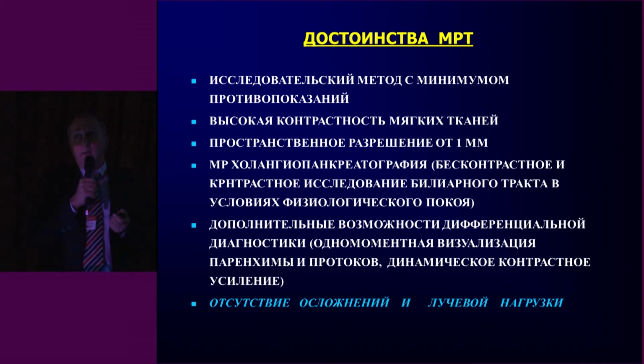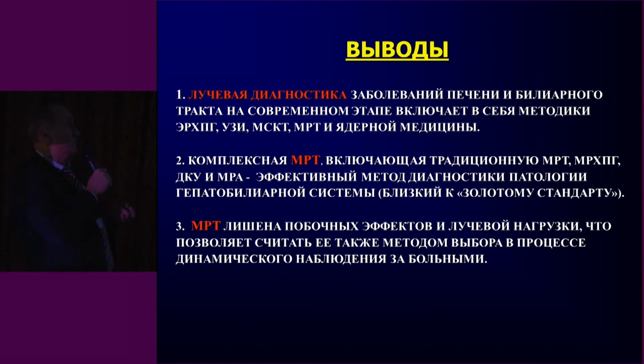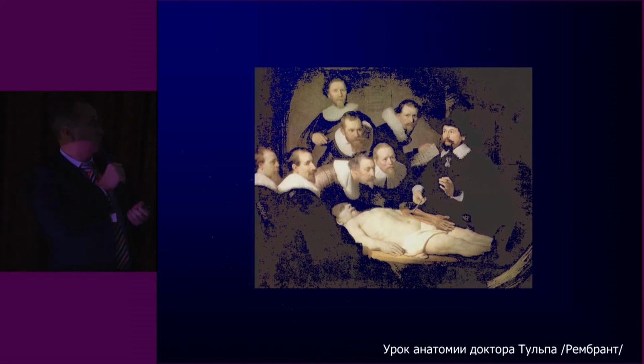Of course, MRI has lots of advantages, but my point of view is that the basic method for differential diagnosis of the pancreas is a CT scan. Then MR studies are the gold standard for diagnosis of biliary and liver disorders. For the gallbladder, ultrasound is quite sufficient.